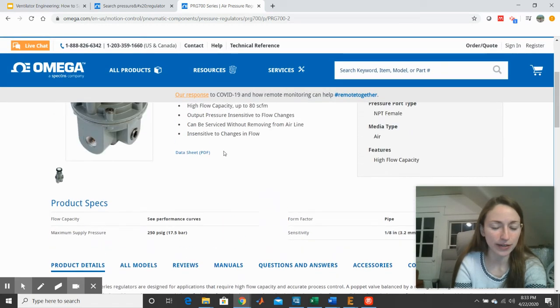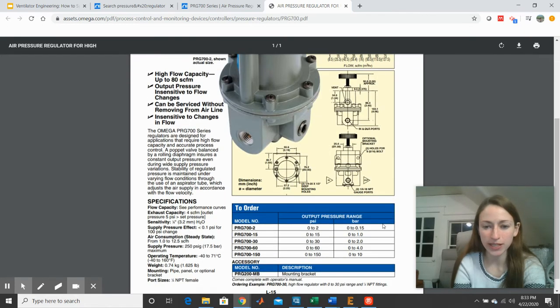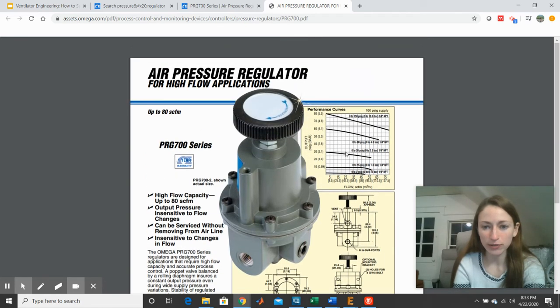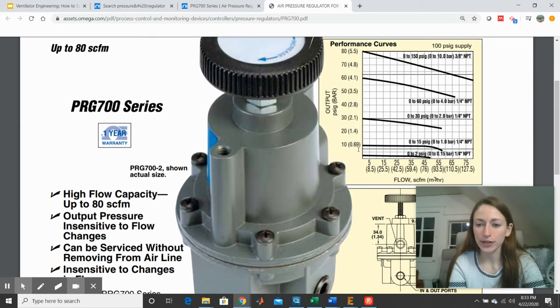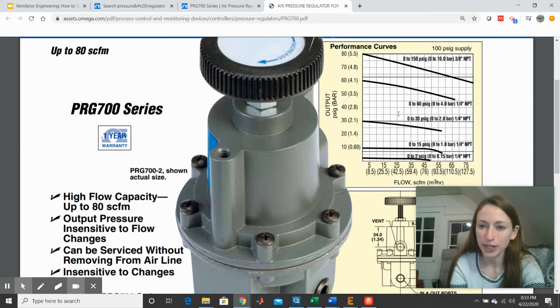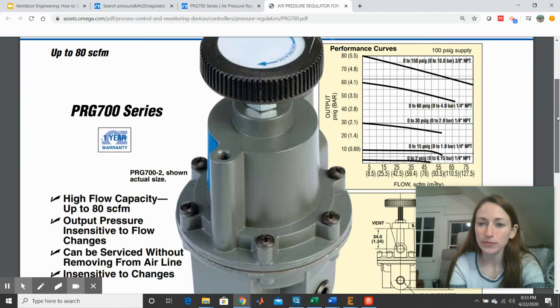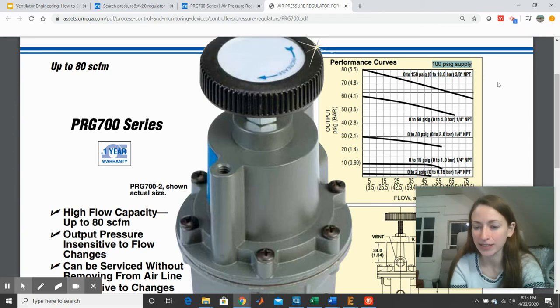And then I'm gonna, after skimming these, open up the data sheet, because in addition to the actual technical drawings of the device and the complete list of specifications, what I'm really looking for is this performance curve diagram. I'm sure there are much better explanations of how to read these online, but it's really important that you check the performance curves of a pressure regulator in similar devices. Okay, so the way we read these performance curves is that we look at the inlet pressure that they've specified here. This is assuming that you have 100 psi at the inlet of the device.